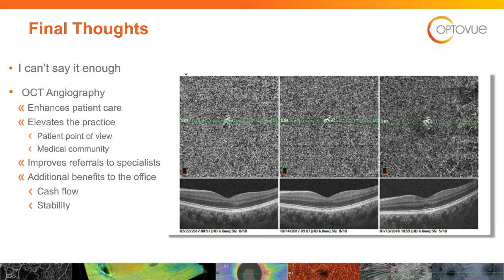First question, how does OCT aid in the diagnosis of optic nerve head drusen and plaquenil maculopathy? OCTA for plaquenil maculopathy isn't the best for that. You would want to go to the B scan. The plaquenil maculopathy is more of a structural change rather than a vascular change. So this is one where I really can't tout OCT angiography. It goes back to your traditional B scan.